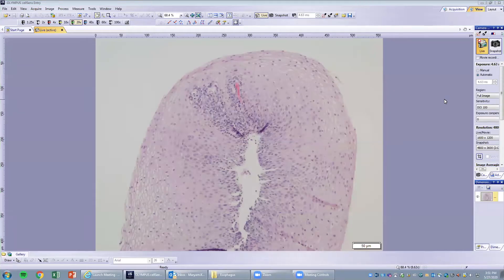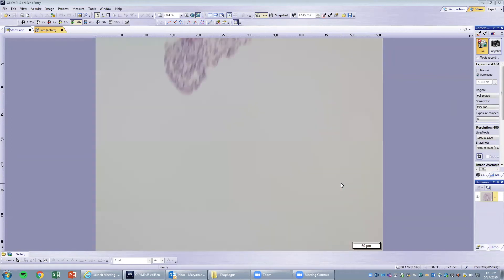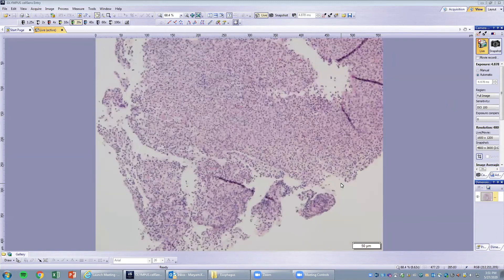Third case — this is an esophageal biopsy of a patient who presented with an ulcer in the mid-esophagus. You can see squamous epithelium, basal cells, and maturation. There's a little bit of inflammation, some lymphocytes here and there. Looking around, here you have a big ulcer with lots of inflammation.